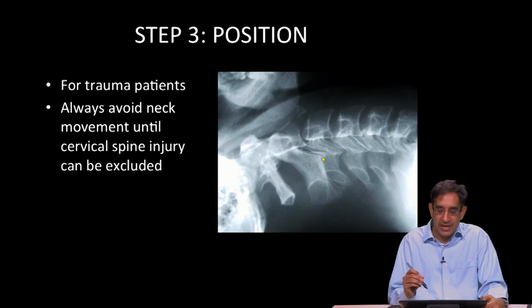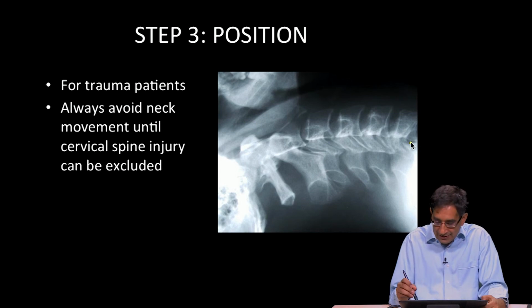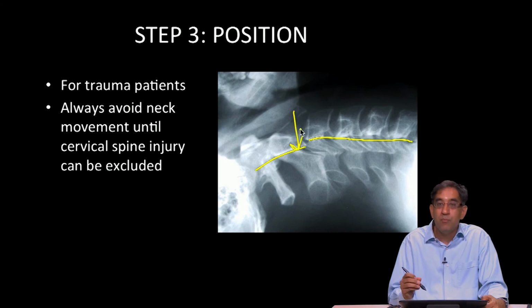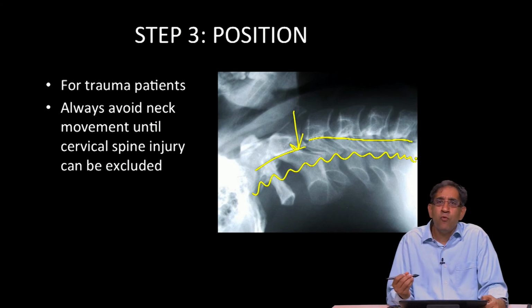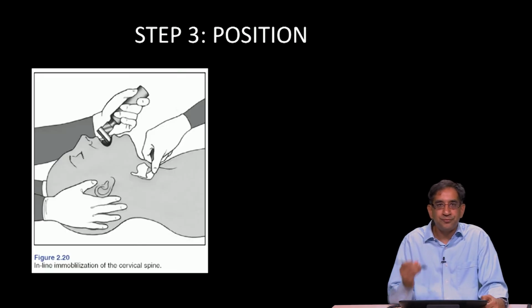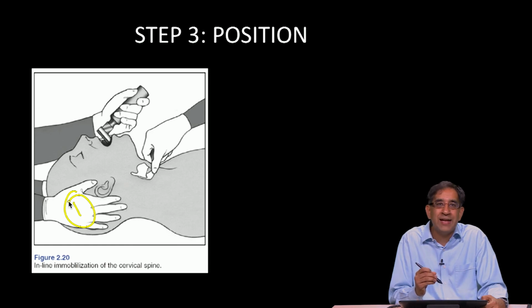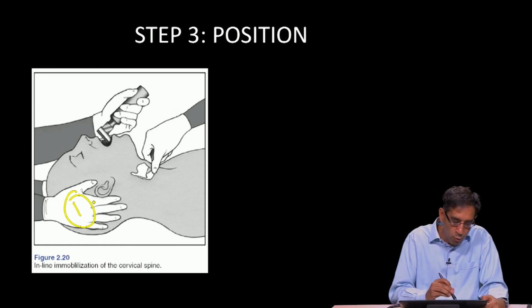Also in patients that have sustained trauma, as I mentioned, be very careful about extending the neck. As I've shown you before, in a patient with a ligamentous injury, the bones can move and you can injure the spinal cord, which lives back here. So what do we do in those circumstances? If we're focused on doing the procedure, how do we make sure that the head doesn't move? The way you do it is you have an additional person whose job is just to hold the head in the neutral position.